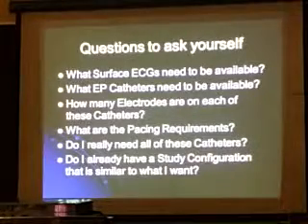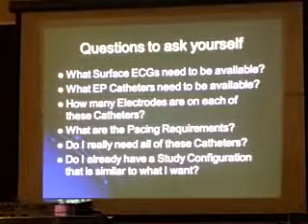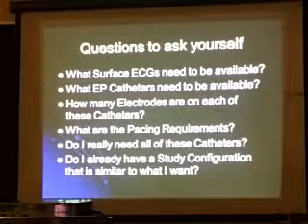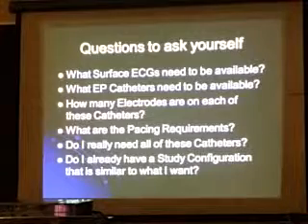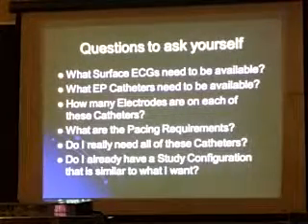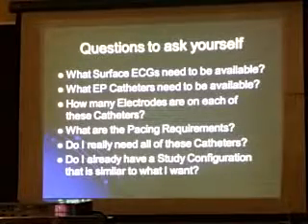If I know I'm going to be doing atrial pacing and ventricular pacing and CS pacing and ablation pacing, maybe I want to make sure each one of those catheters is on its own separate hardwired channel. And I really wish I would have known that when I first started, because I really screwed up some study configuration. Which means I did a lot of clicking. Okay?